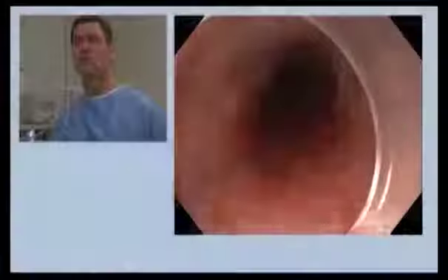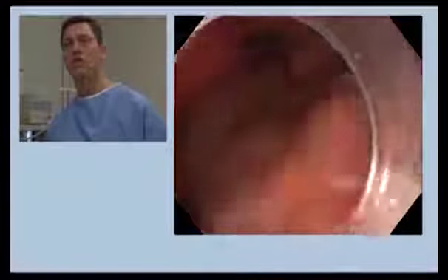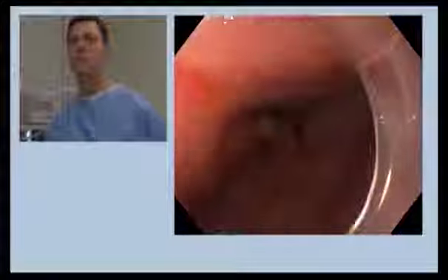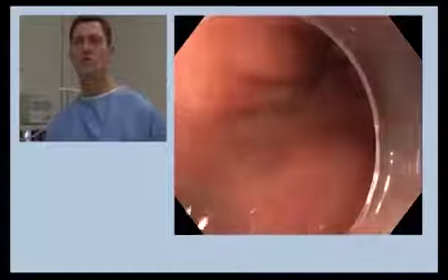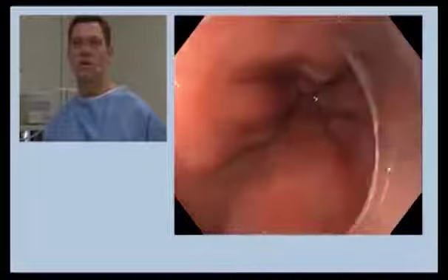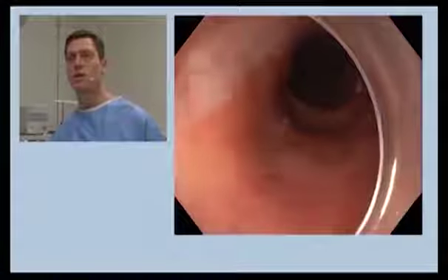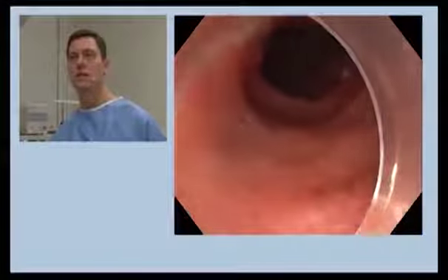Jürgen, we're going over to Mr. Poll. This is the state that we found. We'll just be taking a look at this Barrett's segment. This is the esophagogastric junction. And we've got clear inflammatory changes in the Barrett's here. And that's making life difficult for us, of course. And now we're going to take a closer look at the former resection field. We'll inspect it in the original state first and move very slowly downward.